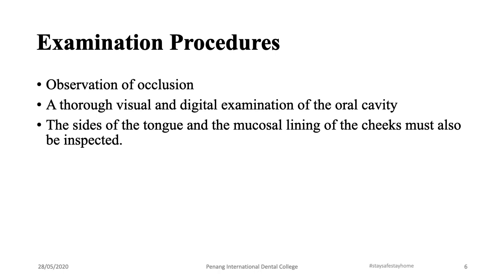First thing, before you ask the patient to take the dentures out, you observe for occlusion. Occlusion basically is simple. With the patient wearing the dentures, you guide the patient to occlusion. You can either ask him to bite by himself, or you could guide it by yourself.